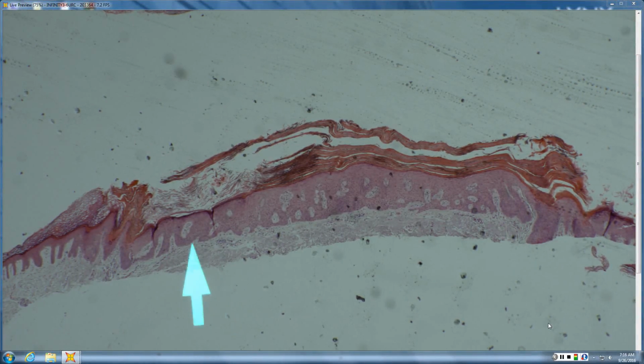Anything goes. So in this case, it's kind of almost psoriasiform hyperplasia of the epidermis with what looks to be confluent parakeratosis. There really shouldn't be any neutrophils in there, though. But it kind of looks almost psoriasiform. And so if you weren't really looking, this is why early on you hate looking at things from scan.